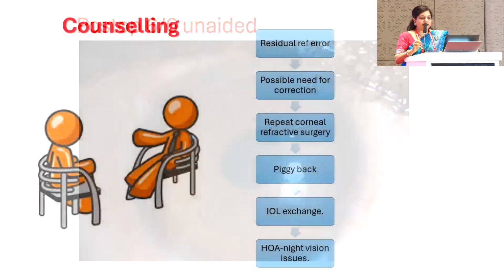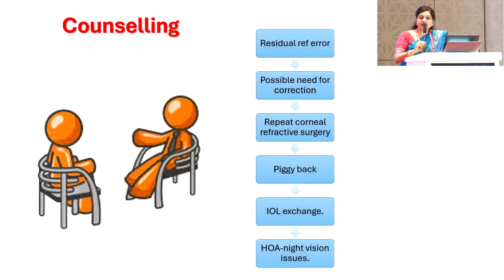Post-op was 6/6 unaided. So you need to counsel all these patients with regard to residual refractive error and possible need for correction, in spite of taking all the necessary precautions, and that they might even need a repeat touch-up, and very rarely even an IOL exchange. Again, night vision issues and higher order aberrations could affect and compromise the quality of vision.